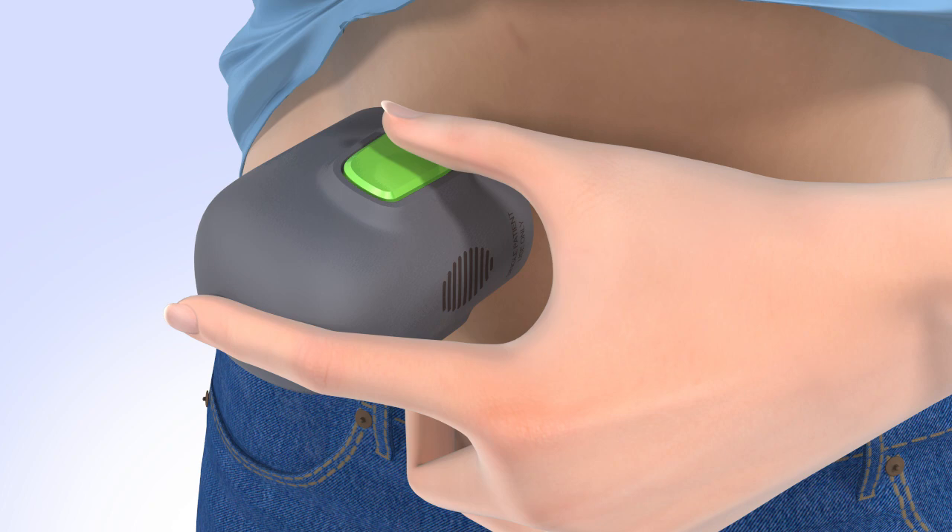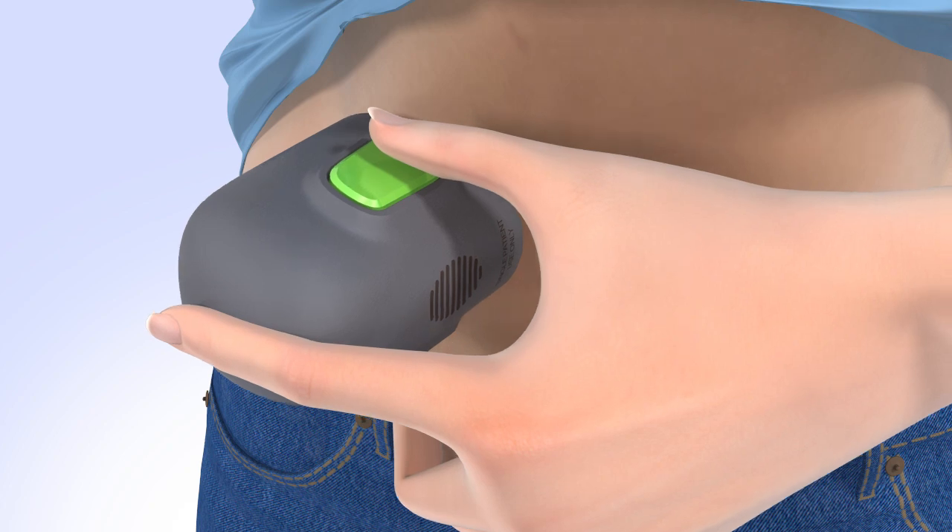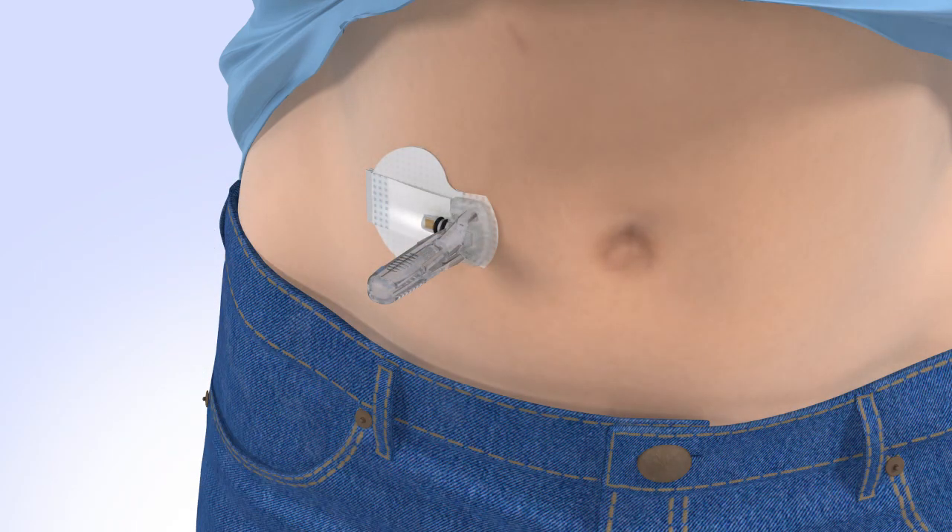Do not pull the serter away from your skin yet. Continue to hold the serter against your skin to allow time for the adhesive to stick. Then slowly pull the serter away from your skin, making sure you do not press the buttons while doing so.